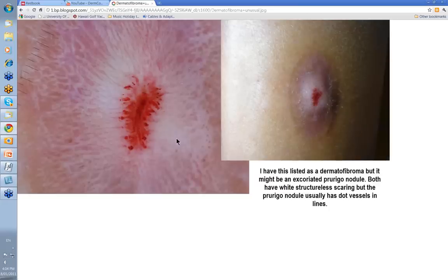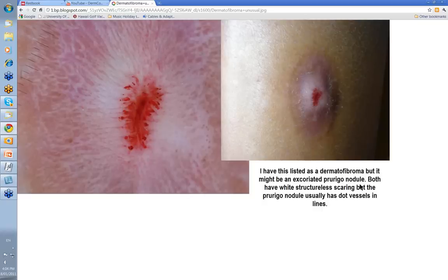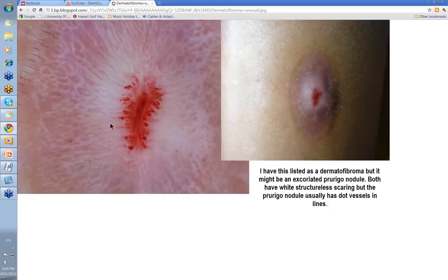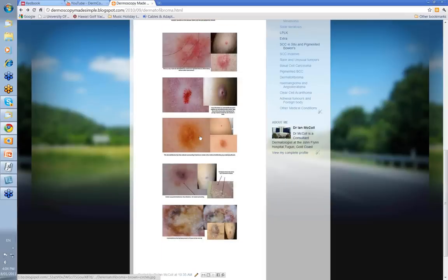Here's another unusual one — I have this listed as a dermatofibroma, but it might be an excoriated prurigo nodule. A prurigo nodule is a thickening of fibrous tissue, epidermal acanthosis from chronic rubbing — it's a form of lichen simplex chronicus. Both the dermatofibroma and prurigo nodule have white structural scarring in the center, but usually the prurigo nodule has dot vessels and lines, which we'll show at a later stage. Here you're almost looking at reticulated hypopigmentation — what we used to call negative network. I've got this listed as an excoriated traumatized dermatofibroma.